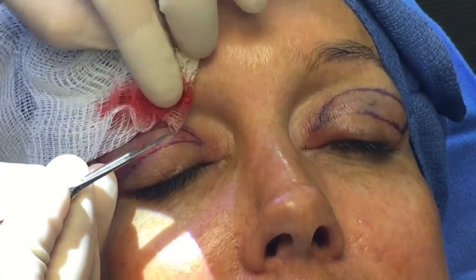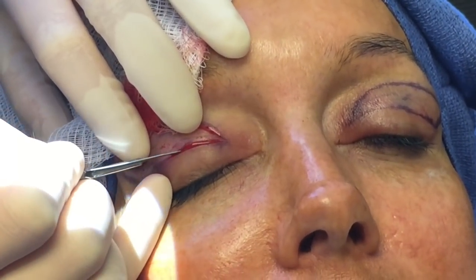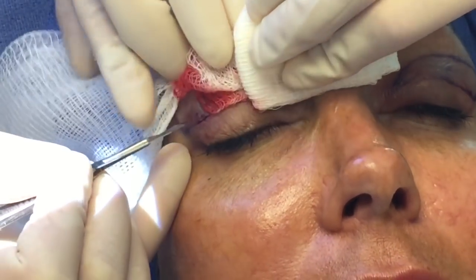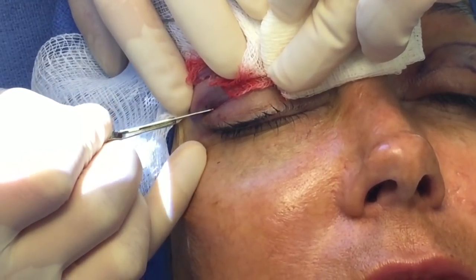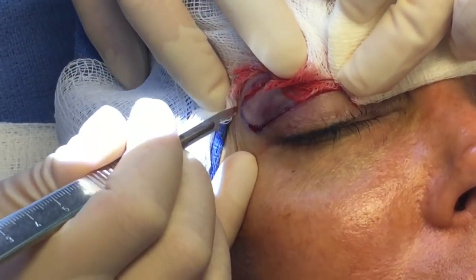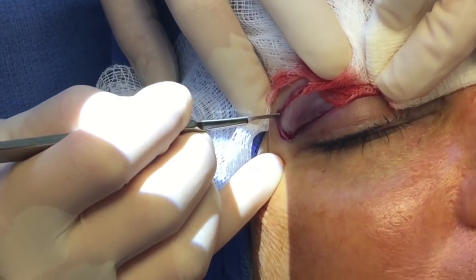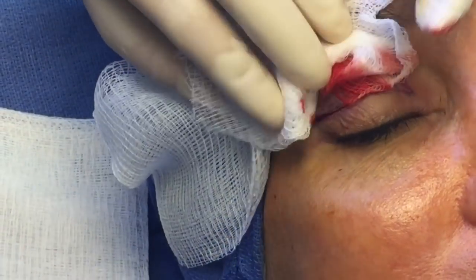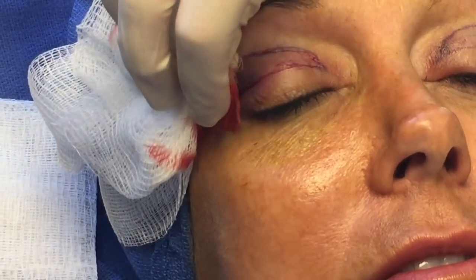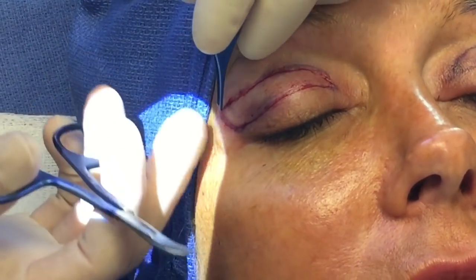I've already made the upper eyelid incision using a 15 blade, which is a sharp instrument, and I'm making the lower incision now. Some people promote using lasers and cautery to make the incision, but in actuality that leaves more scar because of the heat. So this technique is definitely better for scarring. I'm making an incision through the skin — the eyelid skin is extremely thin — and underneath the skin is the muscle. I'm taking off the skin above the muscle, which will be removed to continue the procedure.